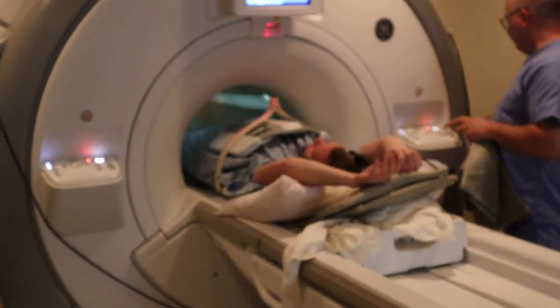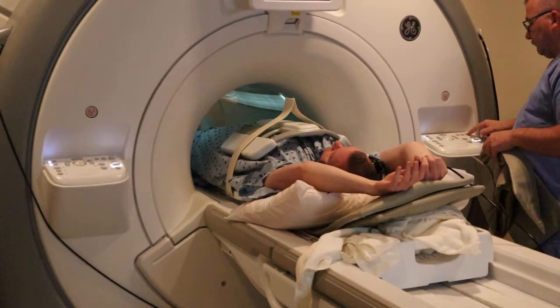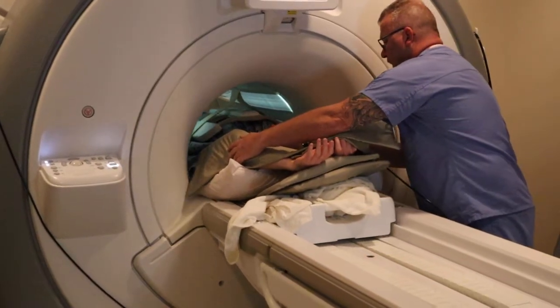You're going to align the coil, landmark, cushion, and advance to scan.